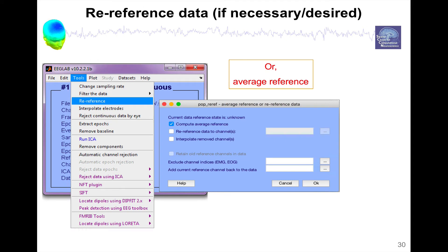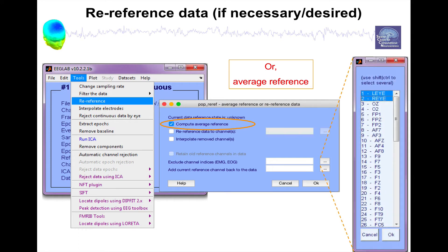Another type of reference is called average reference. Let's go back to Tools > Re-reference and select 'Compute average reference.' When we compute average reference we might decide to exclude some channels — for instance EMG muscle or ocular channels — because ocular channels often have a different reference, referenced with respect to each other. We can exclude these channels from the average reference computation by entering them in this field.